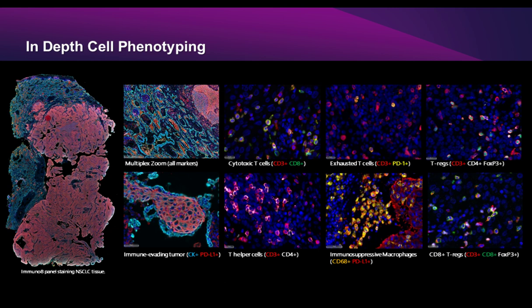I apologize. No problem. Now, different antibodies might have different affinities, so should we perform different antigen retrieval protocols at the same time for multi-staining? So, here at Ultivue, we make sure we optimize all our antibodies for a pH 9 antigen retrieval, or ER2 on the bond. And we haven't come across anything yet that has required variant ways of doing antigen retrieval, like a pH 6 or something like that. Most good high-performance antibodies that are on the market today are usually amenable to using a pH 9 antigen retrieval. So we've been able to standardize quite regularly on that.